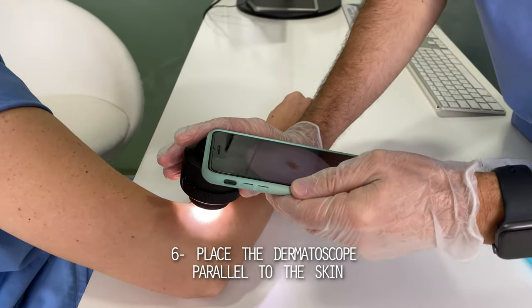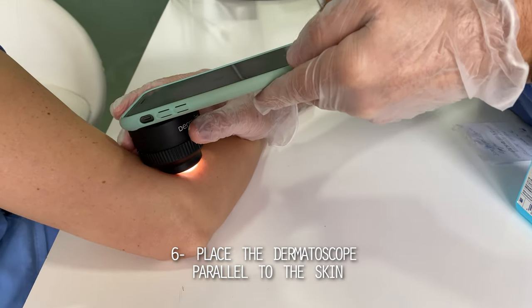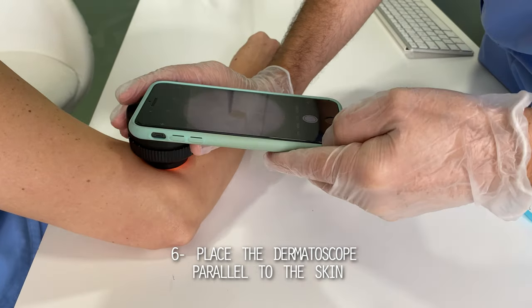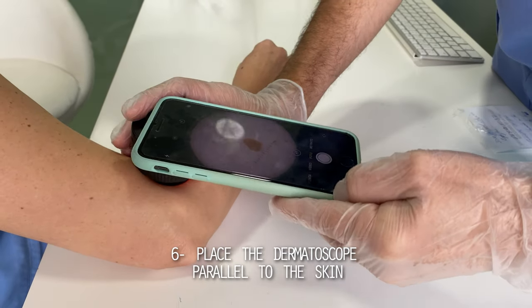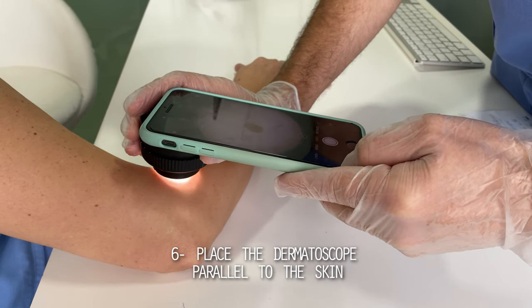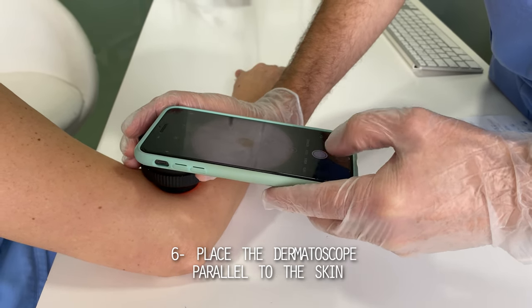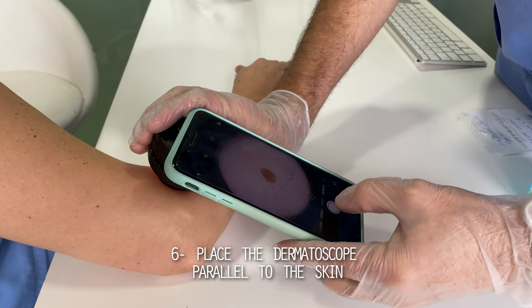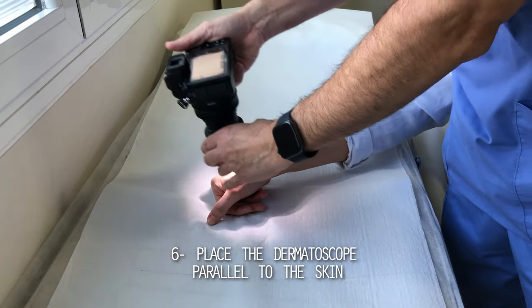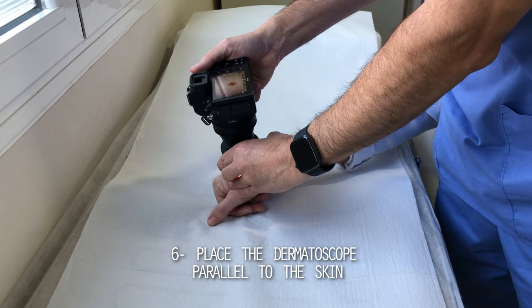One of the most important issues when it comes to getting the best picture is the positioning of the dermatoscope on top of the skin. The faceplate of the magnifying glass should rest completely flat and parallel to the surface of the skin where the lesion is located. In other words, the line drawn from the viewfinder to the faceplate must be at 90 degrees to the surface of the skin.